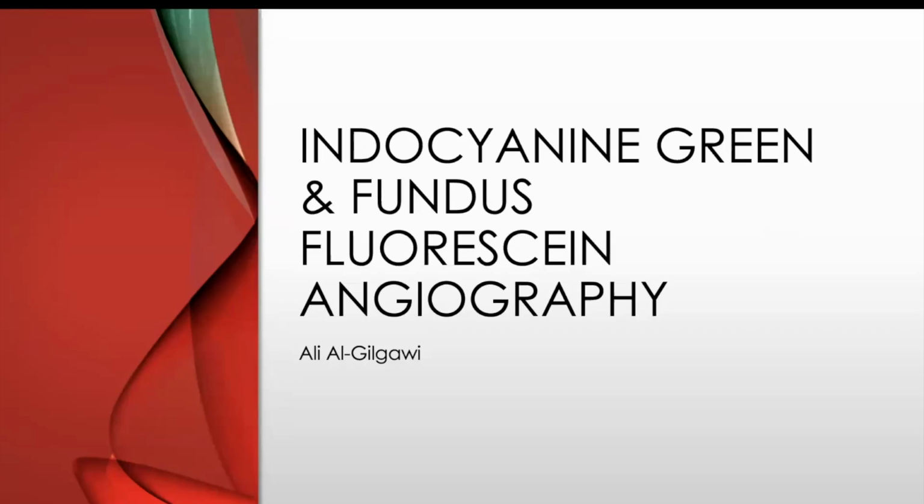Hello, everyone. Continuing on with our investigations, today I wanted to talk about ICGs and FFAs. I'll do a bit of an introductory bit on what ICGs are and some indications, and we'll focus most of our discussion today on FFAs, their indications, the different sort of findings that you'll come across and how some pathologies may look.